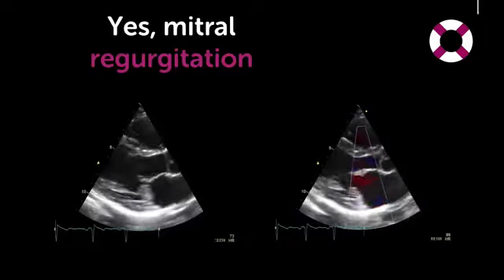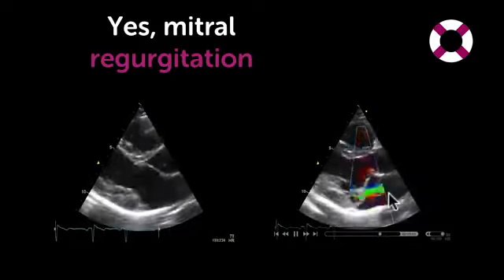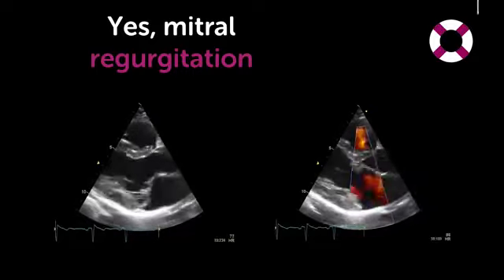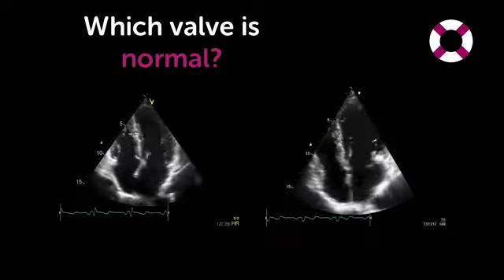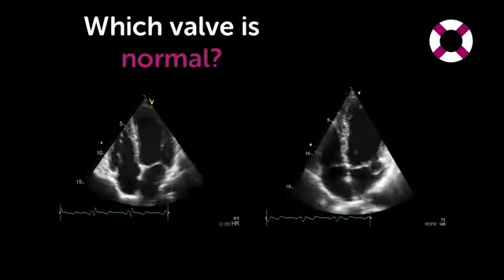And sure enough, the valve is incompetent. This can be seen in the color Doppler here. We'll talk a bit later on how we can discern jets with the help of color Doppler. Are you ready for some more strange looking valves? Can you find the normal and the abnormal? Now in a 4-chamber view.